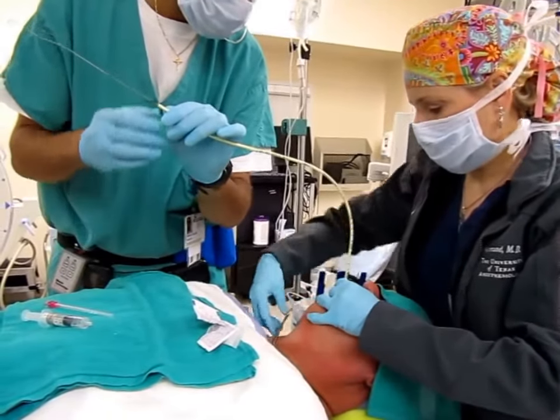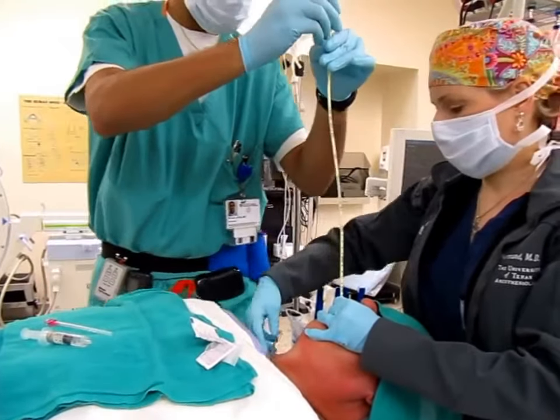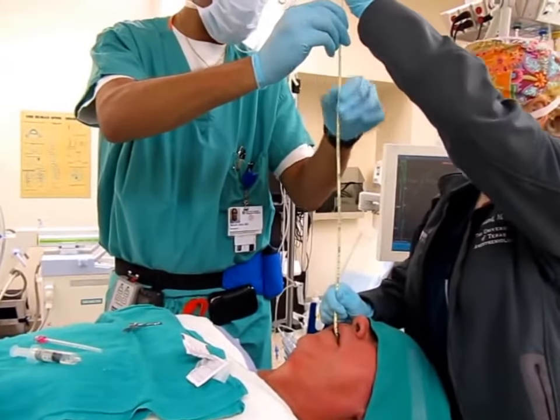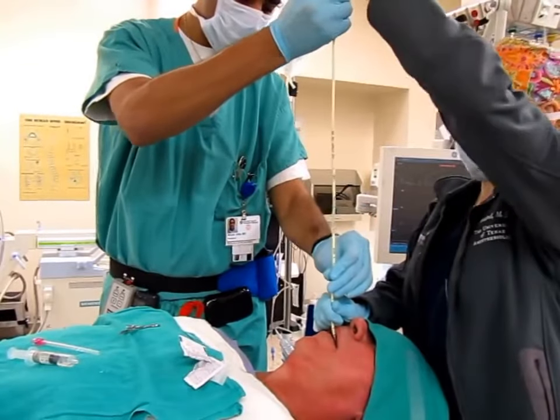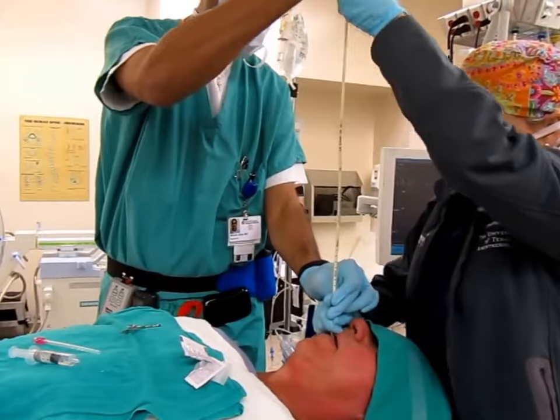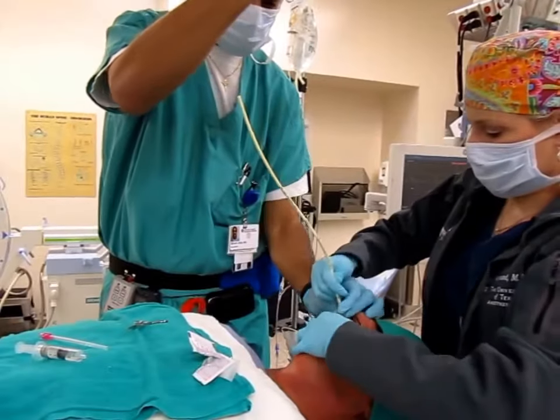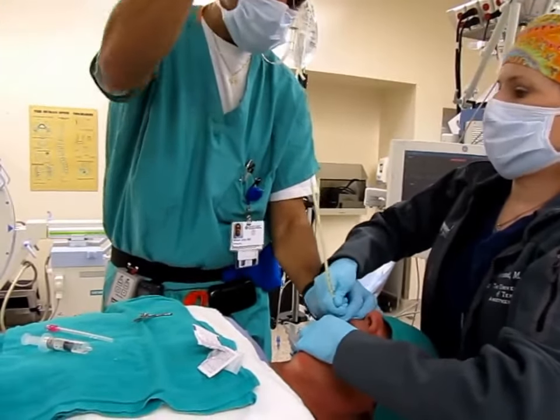Put tension on this — keep nice tension on it. I'm going to let go of the hemostat. Now you're going to pull and push at the same time. You can't push yet until the guide wire is out of the skin, so it's preventing you. Push it — and right when you get past, maintain tension on it. Lance that cook catheter in. Take your guide wire out.